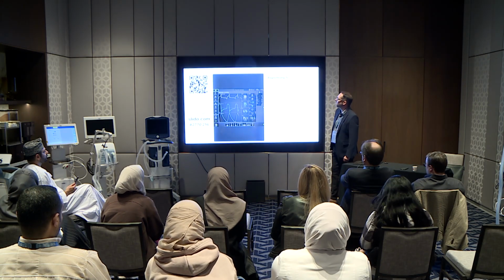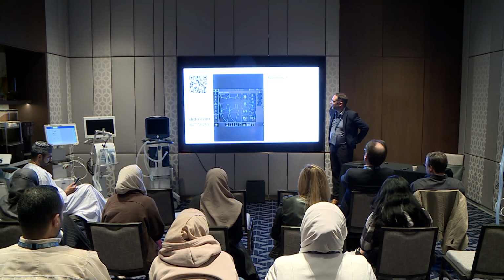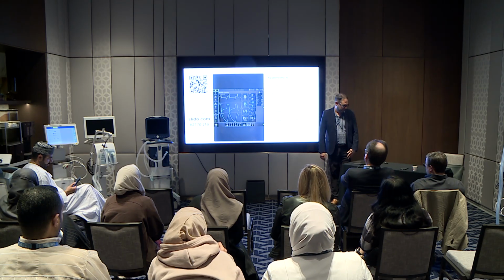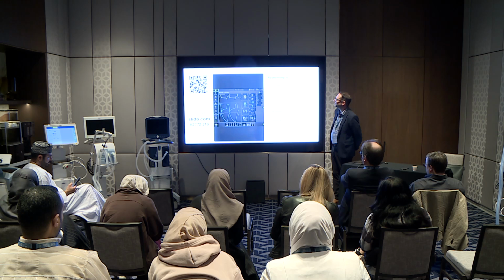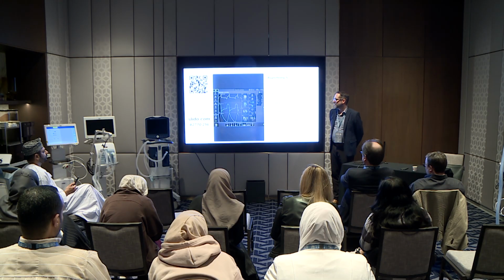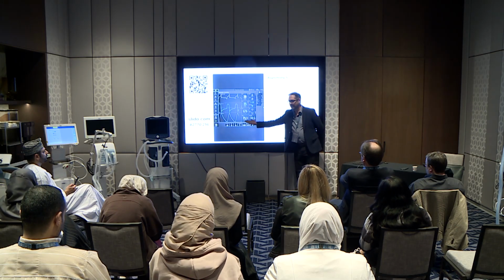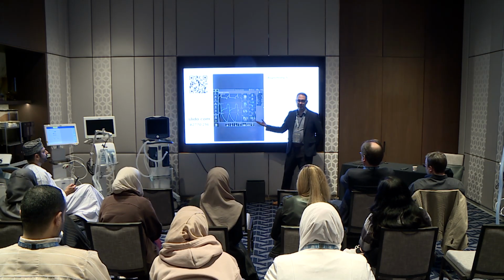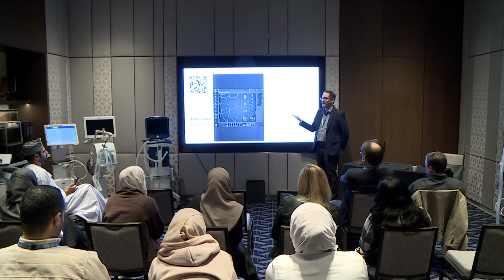Okay. How would I fix this? Or how could I adjust the ventilator to better match with the patient, I should say? And there's a couple options here. Again, if I didn't tell you the story, or if it wasn't clear that the patient is developing ARDS and the tidal volume is already high, I would argue that one of the options, I'll give this away, would be to increase the inspiratory pressure.